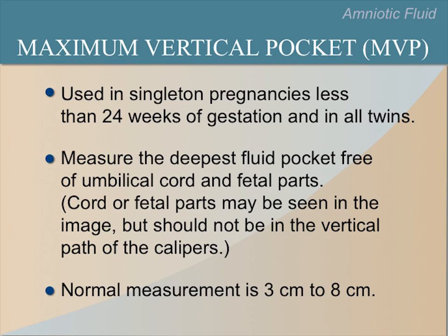To find the MVP, locate the largest pocket and measure its vertical height. If there are twins, we measure the largest pocket for each twin. Measure the deepest fluid pocket, free of umbilical cord and fetal parts. Note that cord or fetal parts may be seen in the image but should not be in the vertical path of the calipers. A normal MVP measurement is between 3 and 8 centimeters.